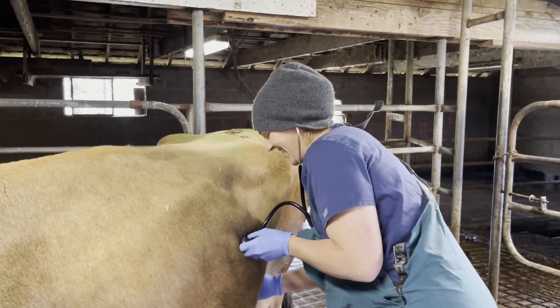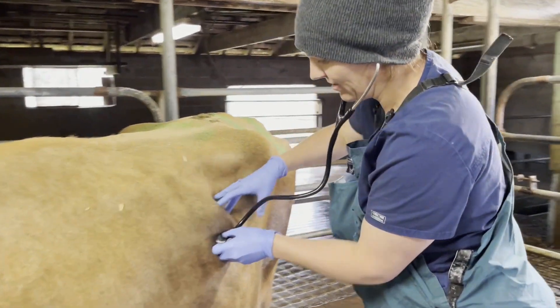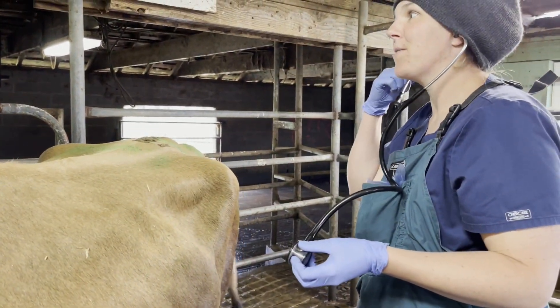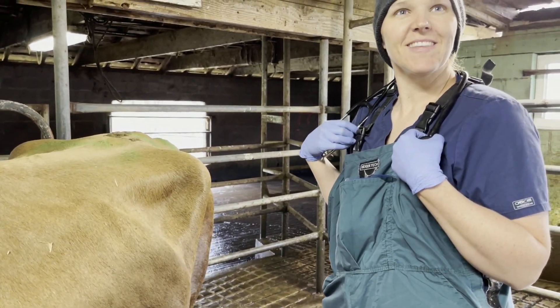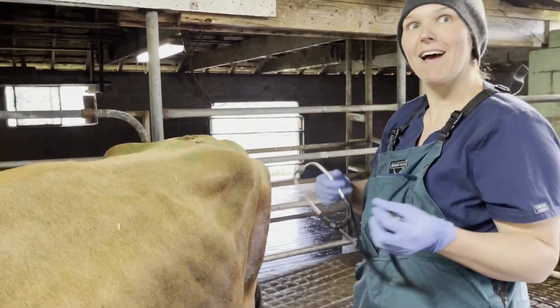What are you doing there Tracy? I'm pinging for a left displaced abomasum. Oh, and what does it sound like? It sounds like if you flick a basketball. Or I like to say if you're floating down the river and you ping your tire. It's a high metallic pitch.